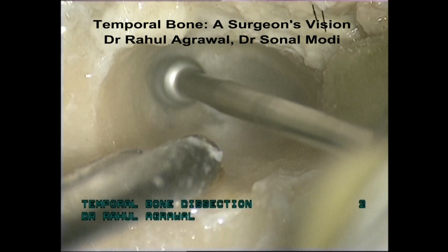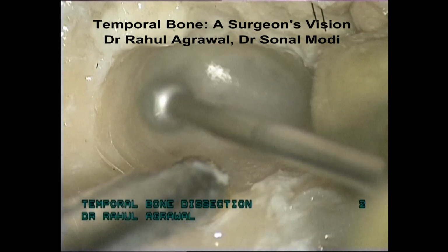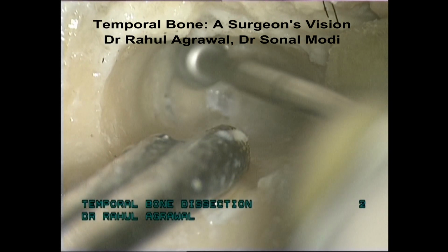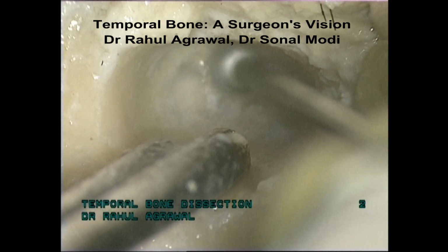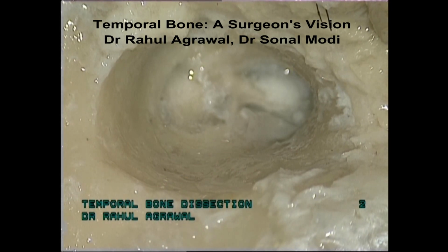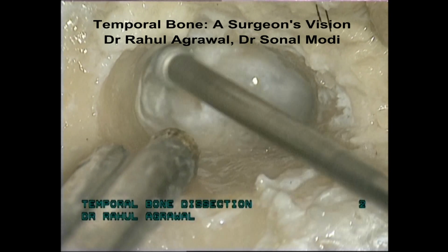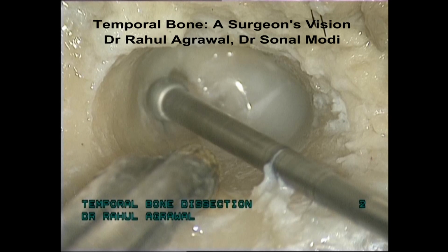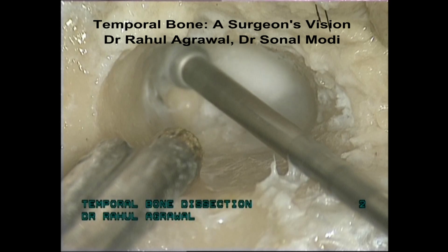That's the area of anterior buttress. If your cholesteatoma sac is limited to the attic or up to the antrum, then you can preserve the anterior and the posterior buttress without compromising on the sac removal, because these will help you when you are trying to reconstruct the attic or the antrum with the help of a cartilage. These give a sort of support on the medial end to the cartilage used for reconstruction of the attic. We'll be showing you that in the same video.